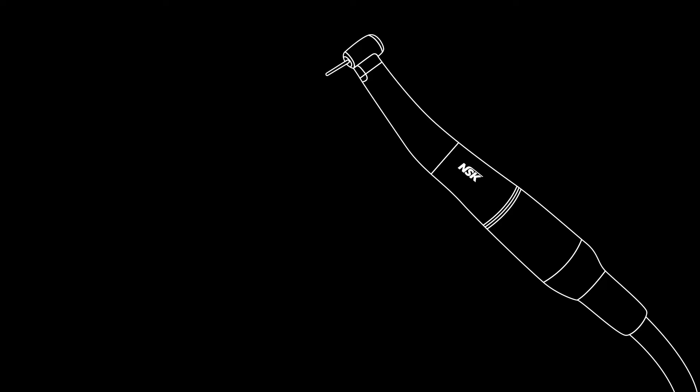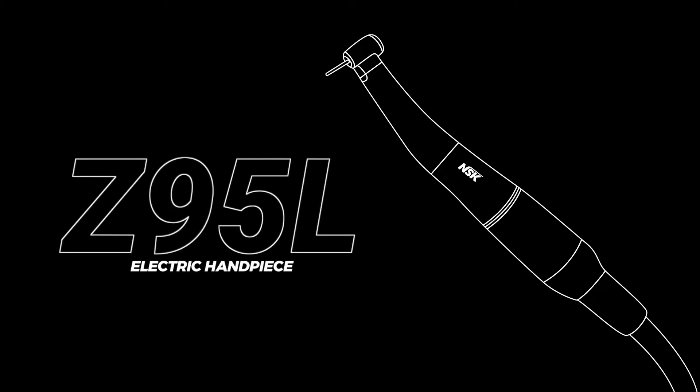When we use a high-speed handpiece to cut off old crowns, the cutting power is not just about the burr speed. Consistently high torque is what matters most, and that's where electric handpieces really stand out.